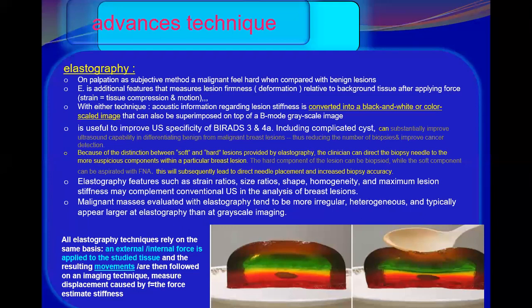It is an additional technique to ultrasound that measures lesion firmness, stiffness or deformation relative to the background breast tissue after applying a force. Strain means tissue compression and motion.